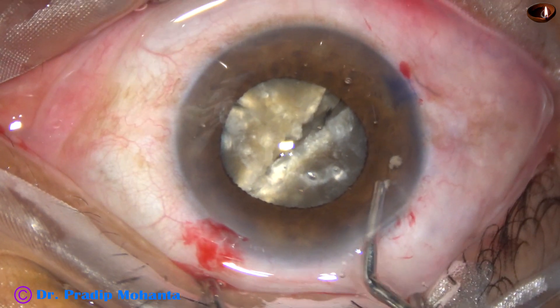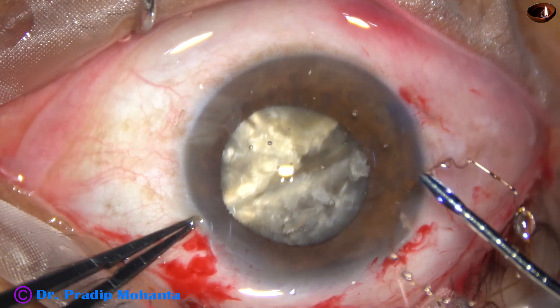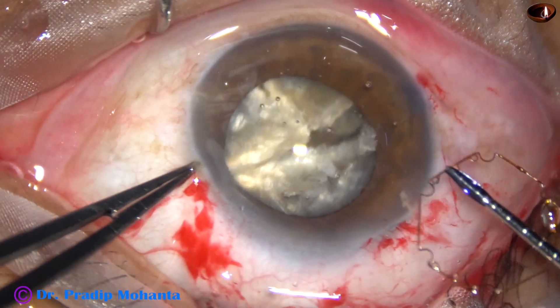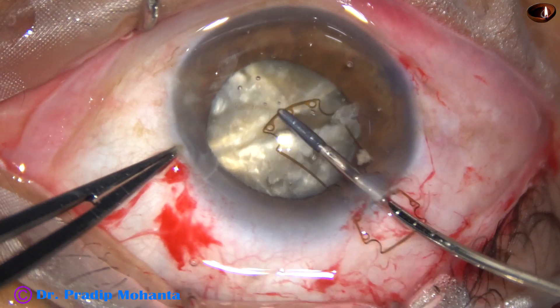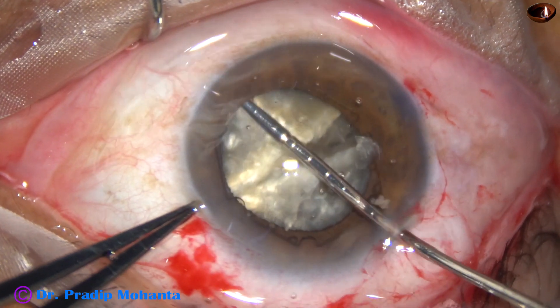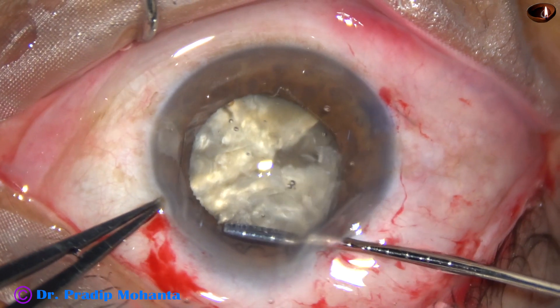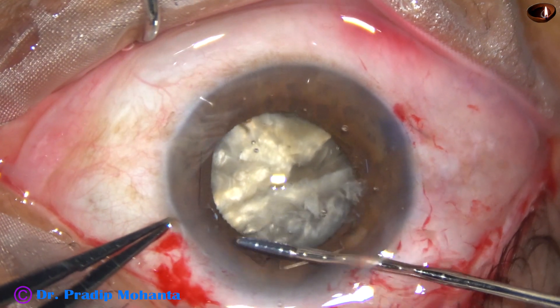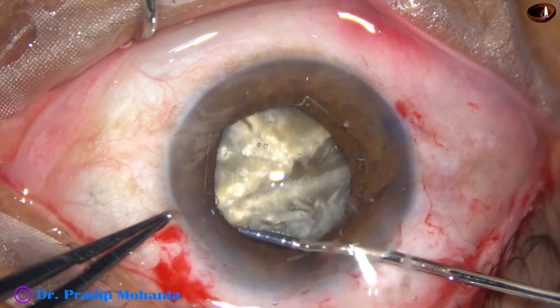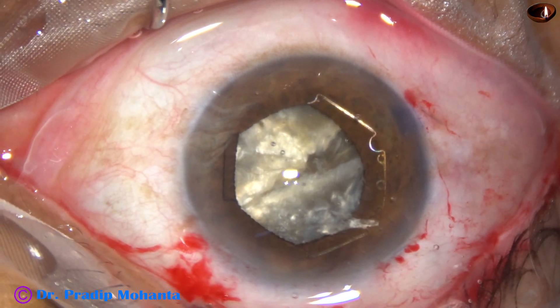I thought of using a pupil expansion device instead of going ahead at this stage. This is a B-Hex pupil expansion device. It has been invented by Dr. Subhan Bhattacharji of Kolkata, India. It has got notches and flanges.